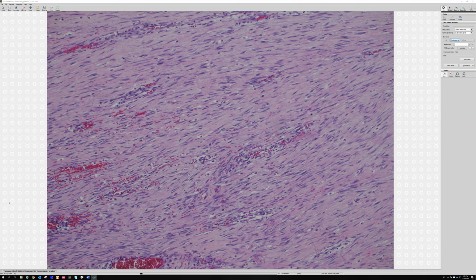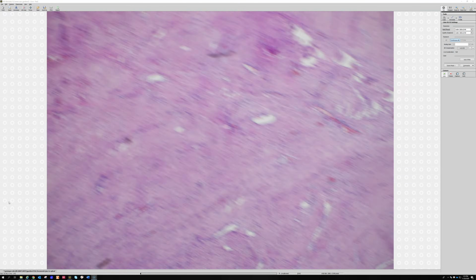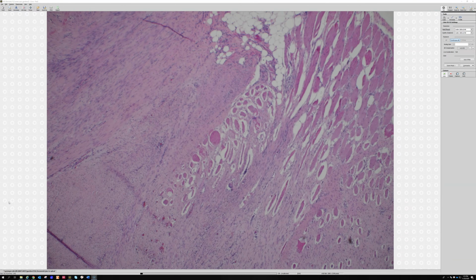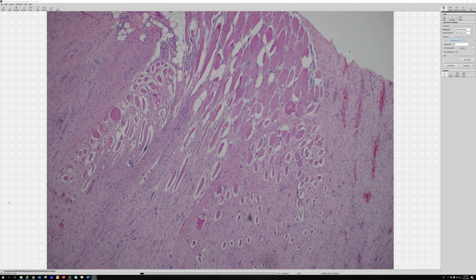So, here's some hemorrhage in it, and sometimes you can get myxoid change and loose, tissue culture-like areas. This particular example doesn't have that. So sometimes you can get nodular fasciitis-looking areas in desmoid fibromatosis. So this one's growing into the muscle, and particularly the ones in the mesentery are sometimes associated with familial adenomatous polyposis. And so the APC gene that's abnormal in that, normally its gene product breaks down beta-catenin, and when it's inactivated, then beta-catenin builds up into the nucleus and then makes the tumor grow. So that's how desmoid fibromatosis works.